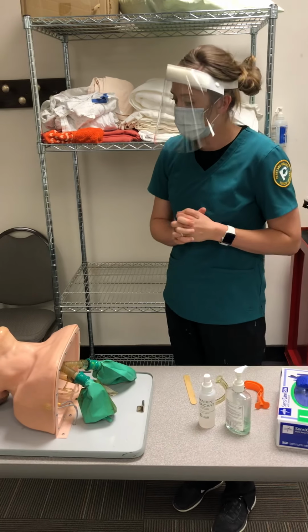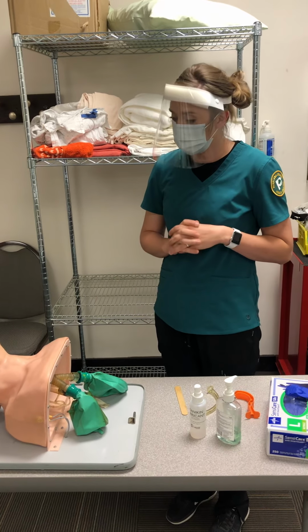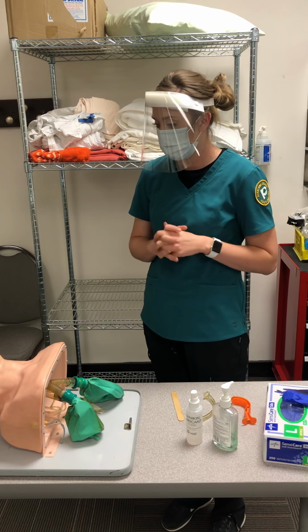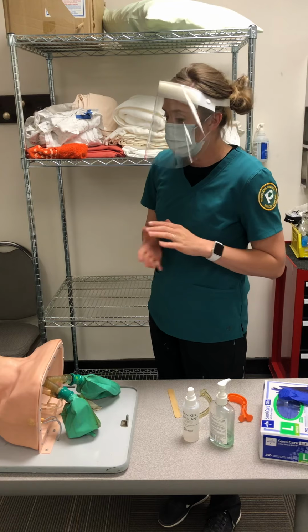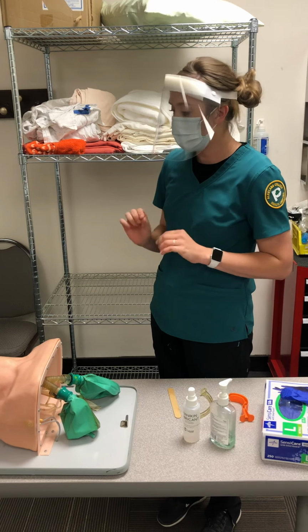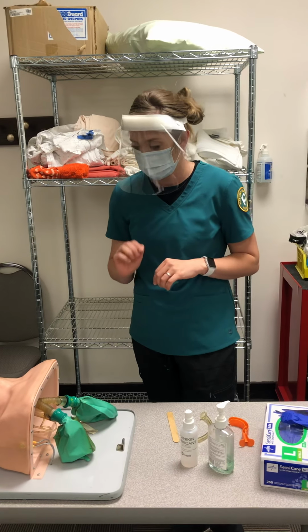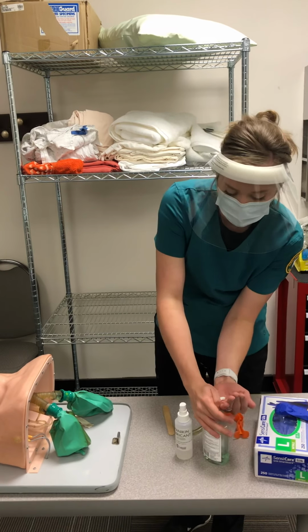Hi, my name is Sarah. I'm going to be your respiratory therapy student today. Can you please verify your name and date of birth? Thank you. The doctor has ordered for us to put a small tube in your nose to help you breathe. Is that all right? Yeah. Okay, and then I will perform hand hygiene.